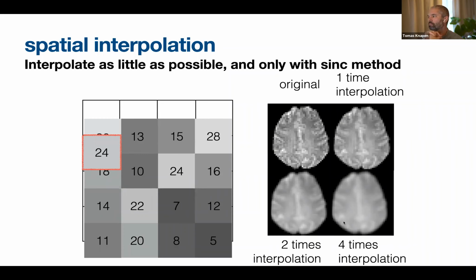Right? So the pre-processing pipelines that we'll be inspecting do exactly this. And this is the way to do it. In many labs, it used to be the case that they would just do this in different steps. And thereby, what you in essence do is you throw away a lot of information. So that is something that is improving drastically in MRI practice.